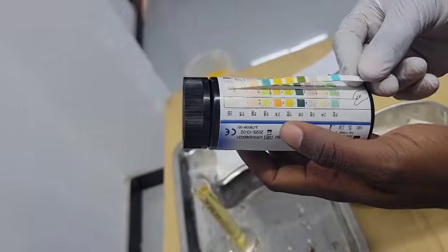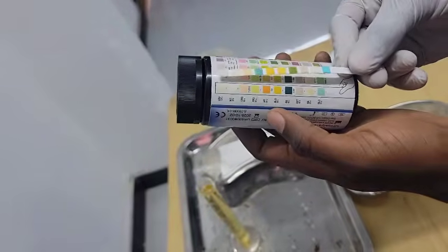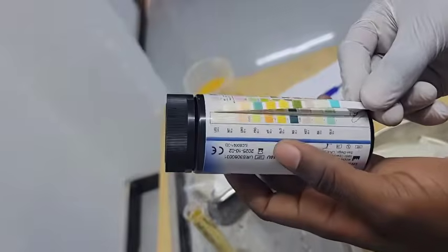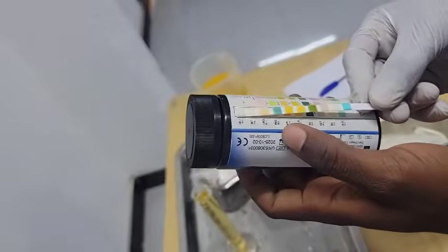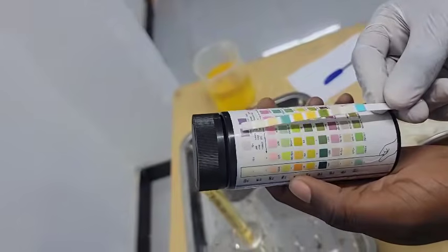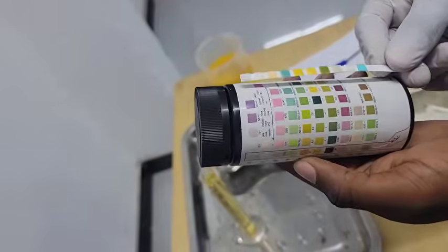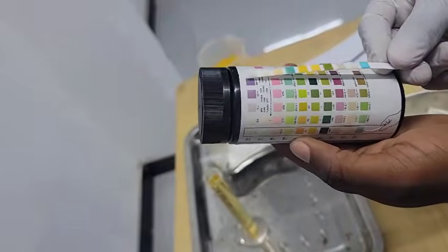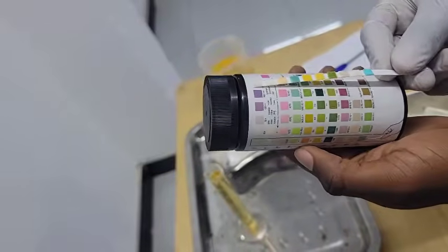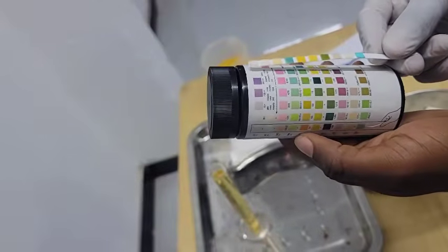It has changed to 6.0, which is normal. There, 6.0. You move to the next one, which is proteins at 60 seconds. So proteins at 60 seconds, it's 4 plus. So you are going to write 4 plus or plus plus plus plus.